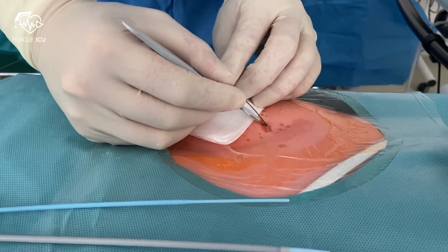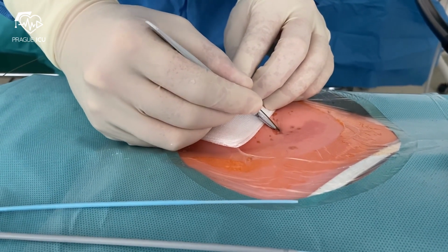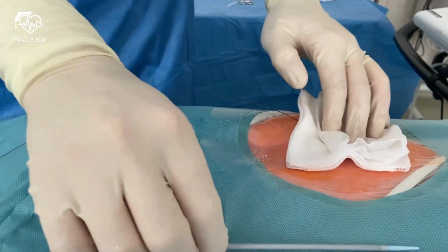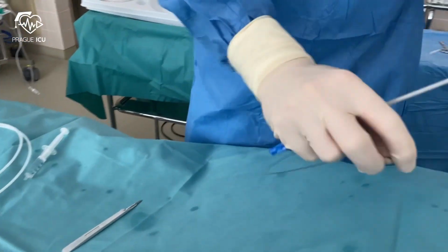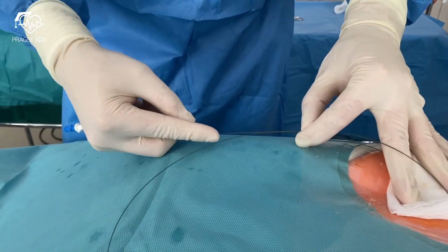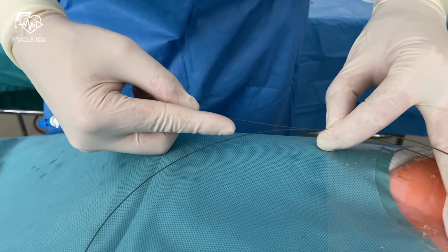Make a small superficial incision at the entry point of the wire that will facilitate the passage of the dilator. Insert introducer dilator into a sheath hub and then pass the sheath over the wire.